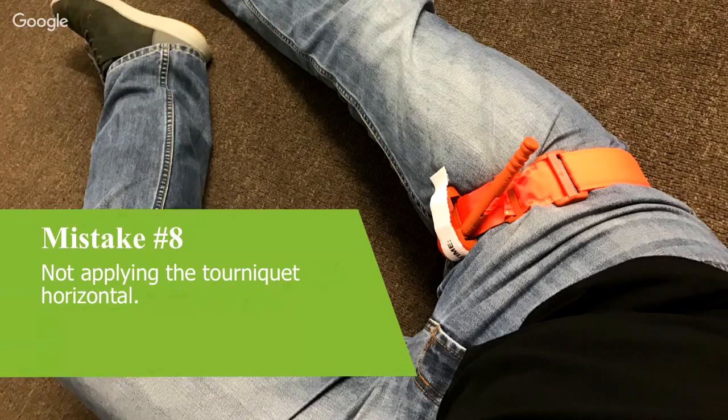But what ended up happening was that person was covered up. They were aeromedically evacuated. When they got to the other end, the tourniquet had loosened completely. It hadn't been noticed, and that patient had re-bled and unfortunately was unsalvageable. Now, what happens in this setting is, if you look at that picture, the distance that you have to cover when you're putting that tourniquet on at an oblique angle is larger than the distance it'll be at when it was horizontal across the limb.